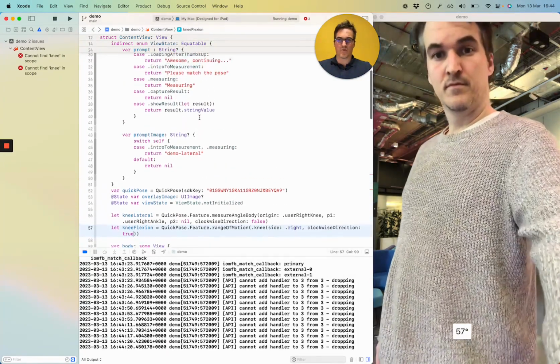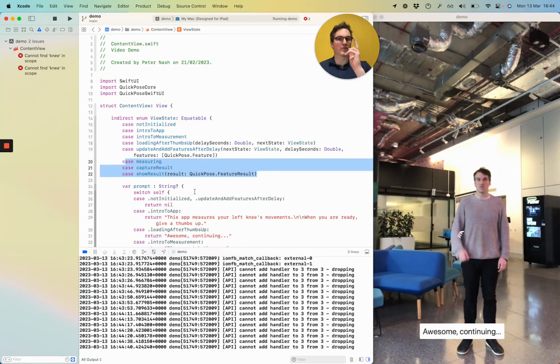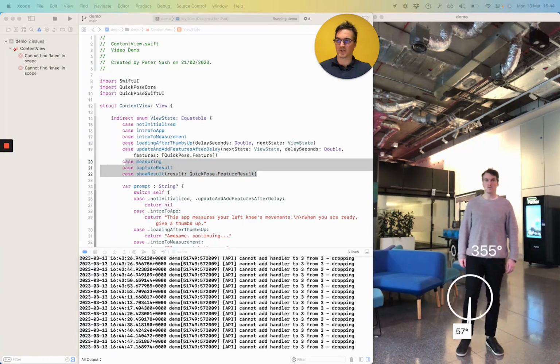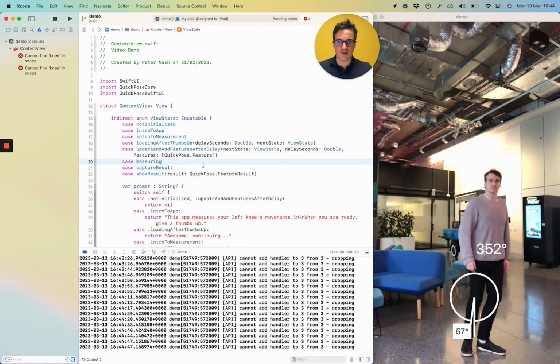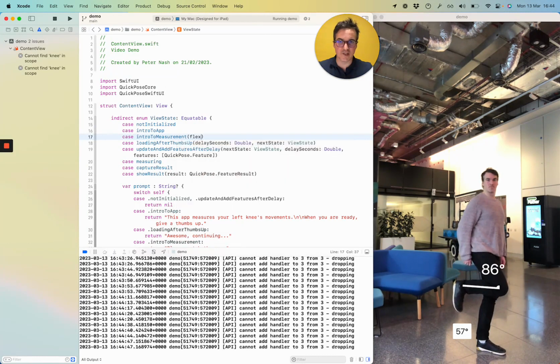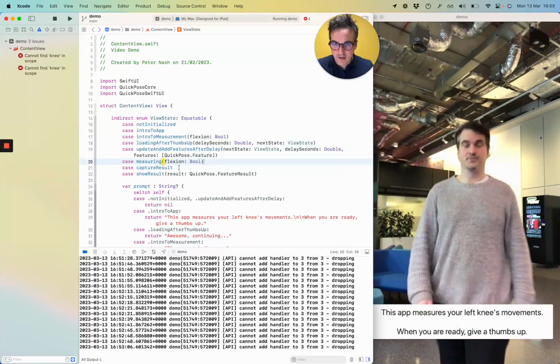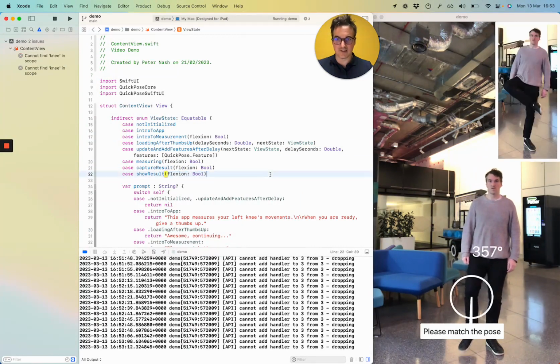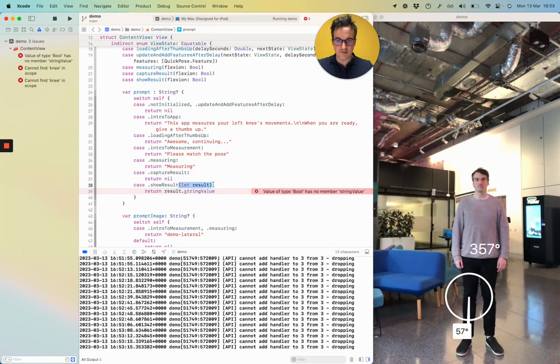So what we'll have to do is to repeat a bunch of these steps for the lateral measurement and a bunch of steps for the flexion measurement. How I propose doing that is to pass a state down them which tells you if it's the lateral or the flexion. Every step along the way keeps track of whether or not it's a flexion state or a lateral state. That means we're going to have to tweak our show result as well. So I'm just going to do a little hack for this for now. Update here.